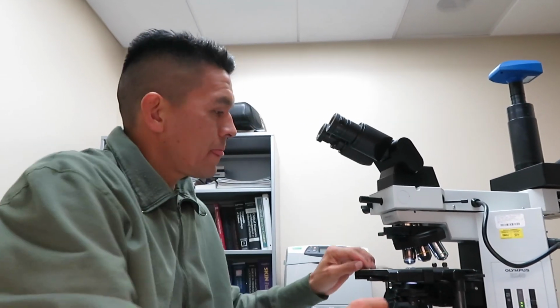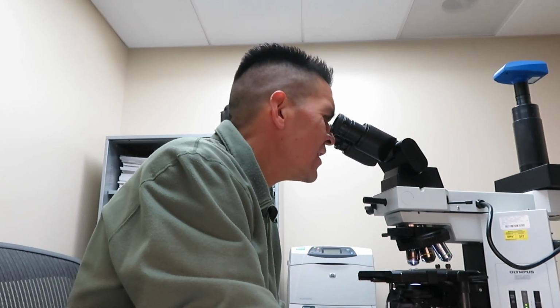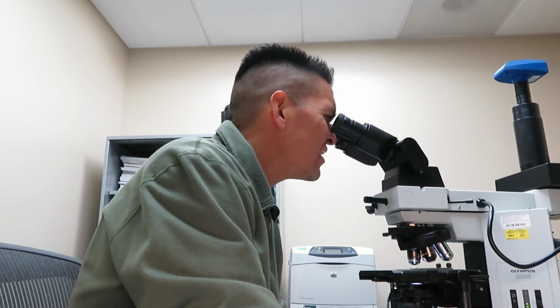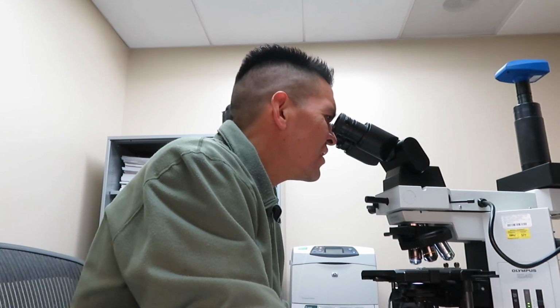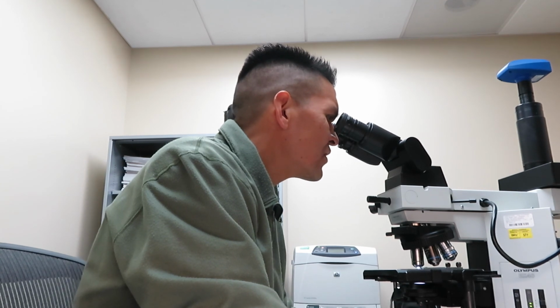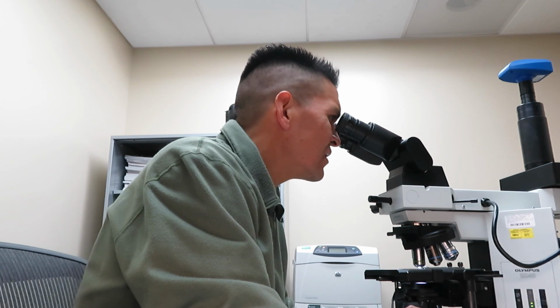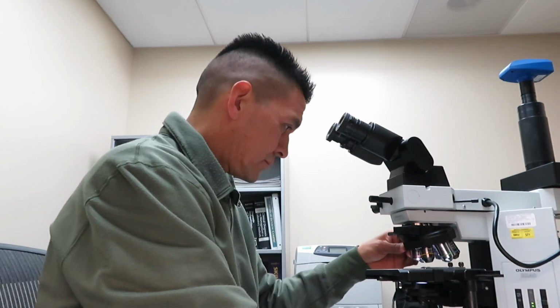Hello again. So here I am in my office, and what I do now is I get a tray full of these slides. I'll put it on the microscope stage, and at this point, in order to show you guys what this entails, here we go.